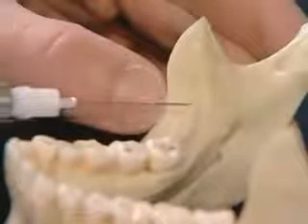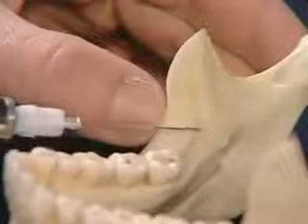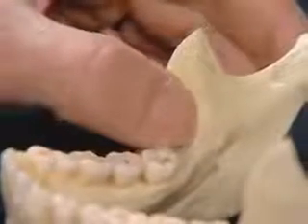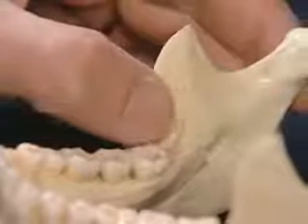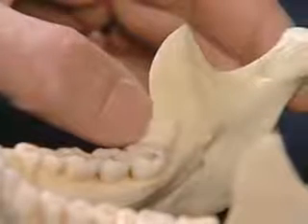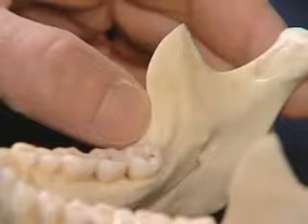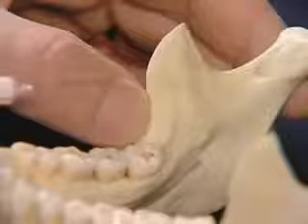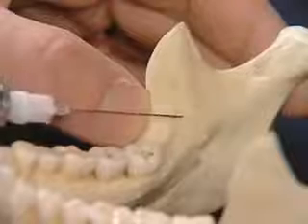The next stage is to palpate the internal oblique ridge, which is the next prominence as you move your finger or thumb in medially, and that should be palpated. A mental note should be made at that point, and then your finger or thumb again withdrawn laterally, pulling the soft tissue landmark with you. It is just medial to the internal oblique ridge that the needle will be inserted.